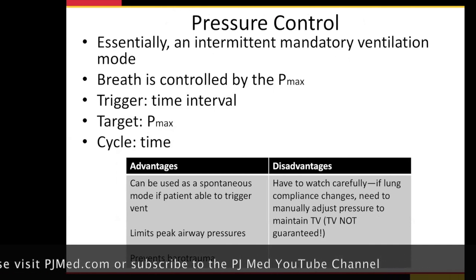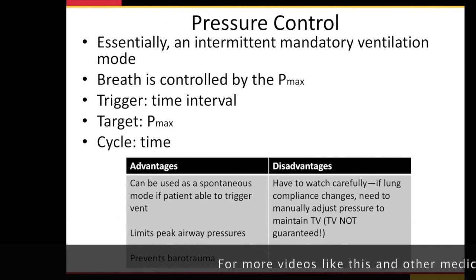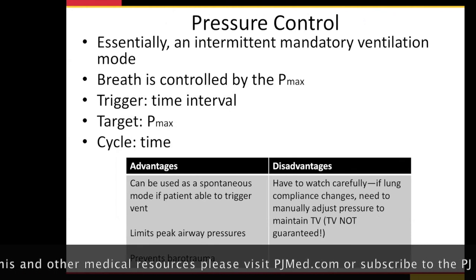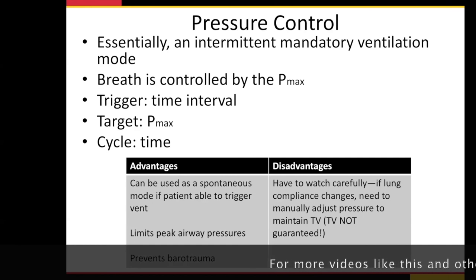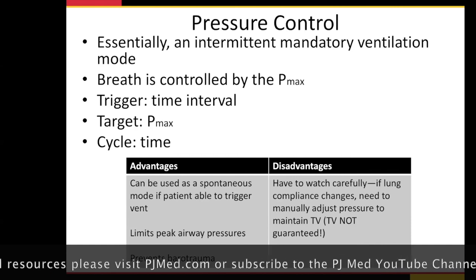Pressure control. Okay, so what if we've got a patient, we're bagging, we just tubed them, and it's hard to bag them? What we're hearing from Italy mostly, and other places, from Korea, some from China, it's hard to get the right information all the time, but from reliable places that are similar to us, the COVID patients actually have really good compliance. You know what that means. After you tube someone, the bag's nice and easy. The lungs are nice and compliant, in and out. They're not real stiff where you're like, wow, I'm really struggling here.